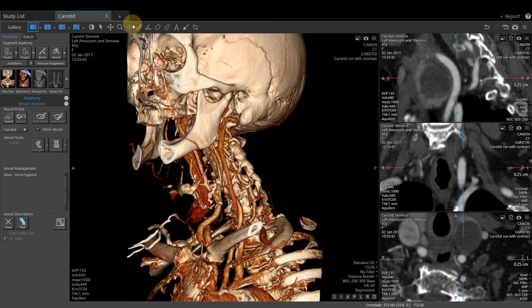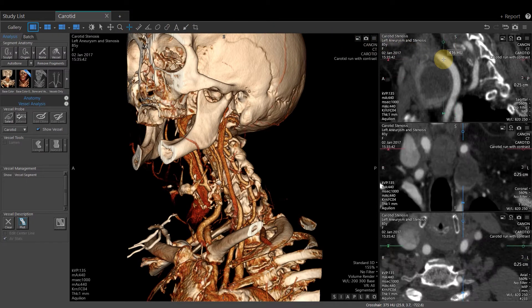It is often useful to determine the Hounsfield unit range in an area of anatomy. We can use the crosshair tool to do this. Left click on the crosshair tool from the Vitria main toolbar, or press H on the keyboard to activate this tool. Hover over the area of anatomy, left click, and hold.